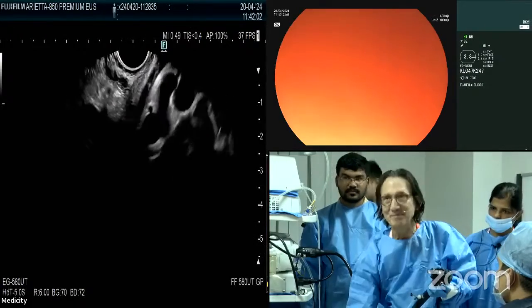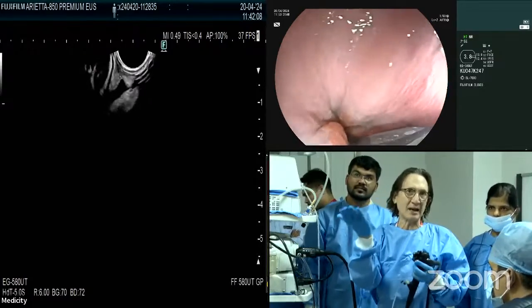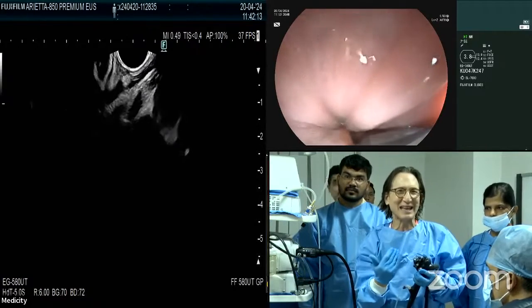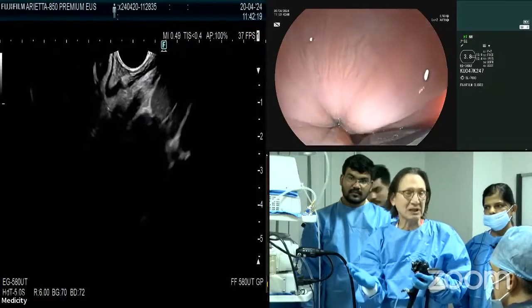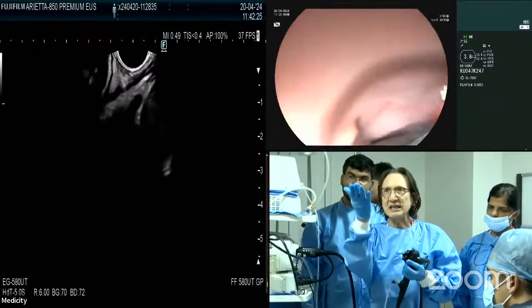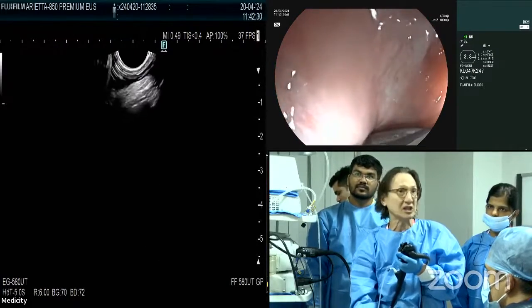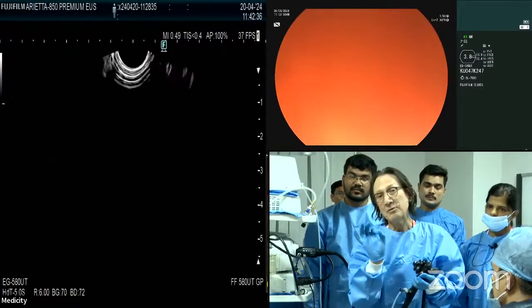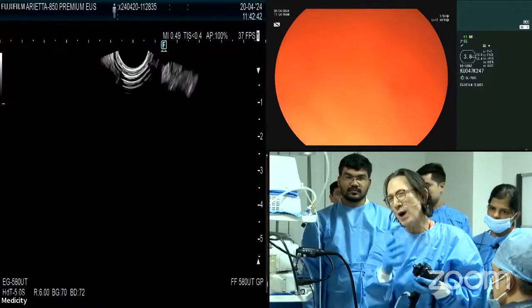With the endoscopic view you'll see beautiful optics. And I want to repeat this: endoscopic ultrasound starts with the endoscopy. You can do everything today with one scope — you don't need to put a gastroscope down first. We see the distal esophagus and we just want to make sure there aren't any large varices here, because we're doing a transesophageal, ideally transcural, access to the gastric fundal varices.